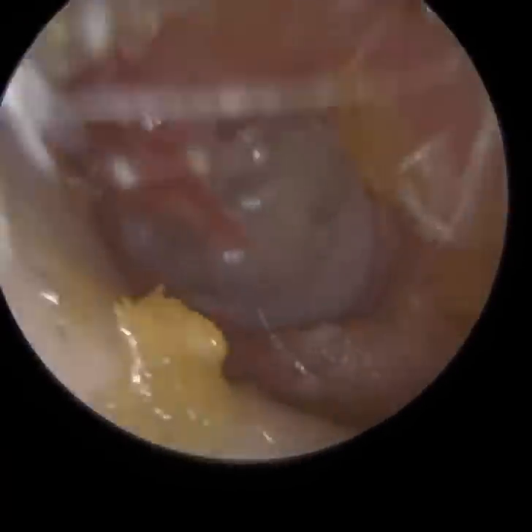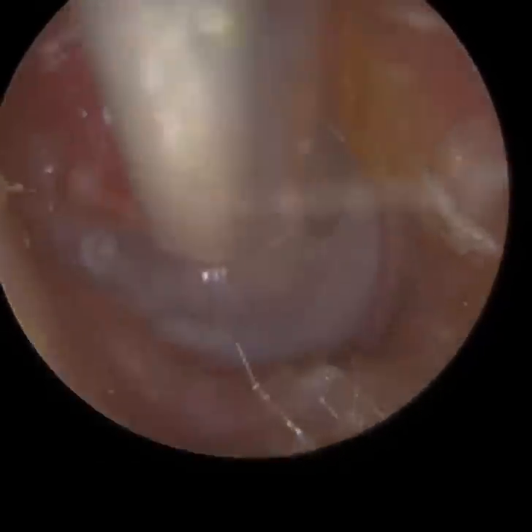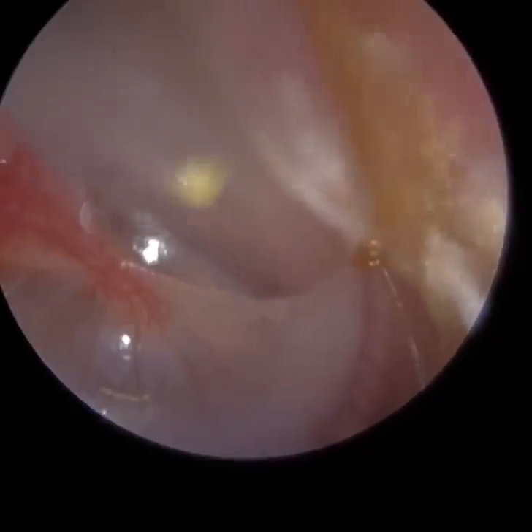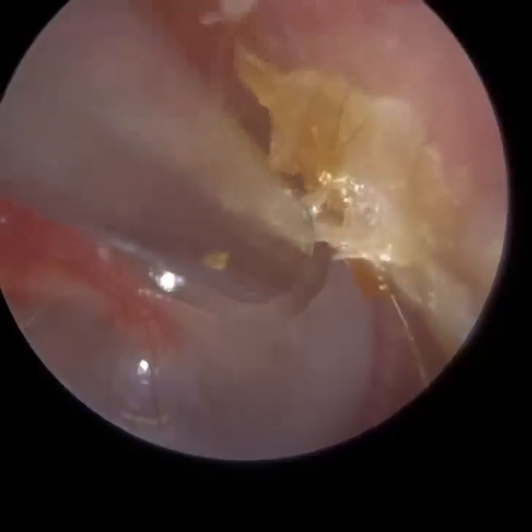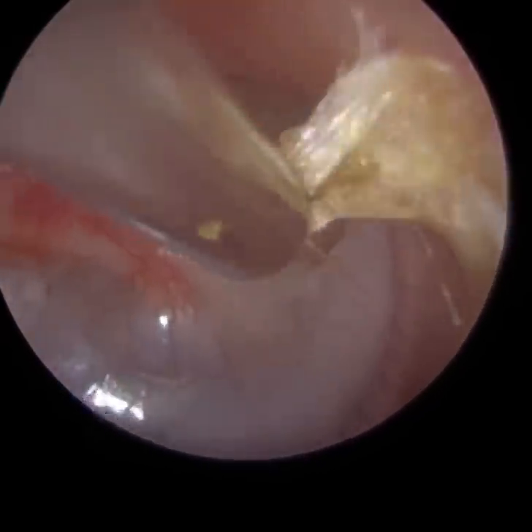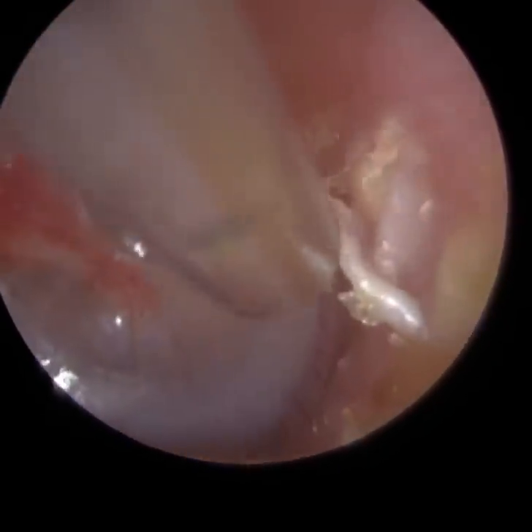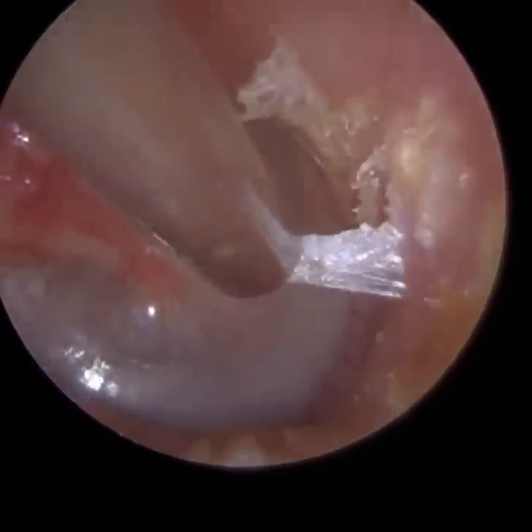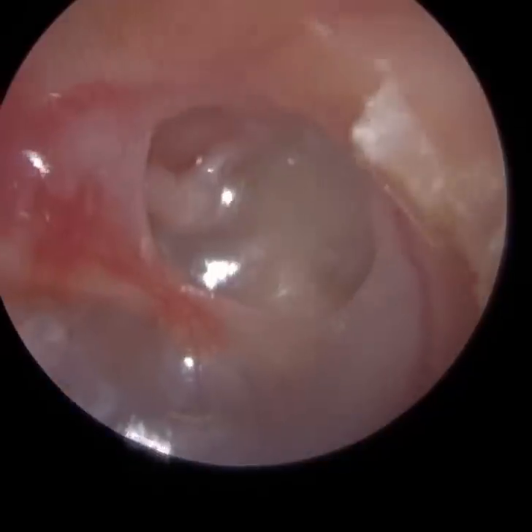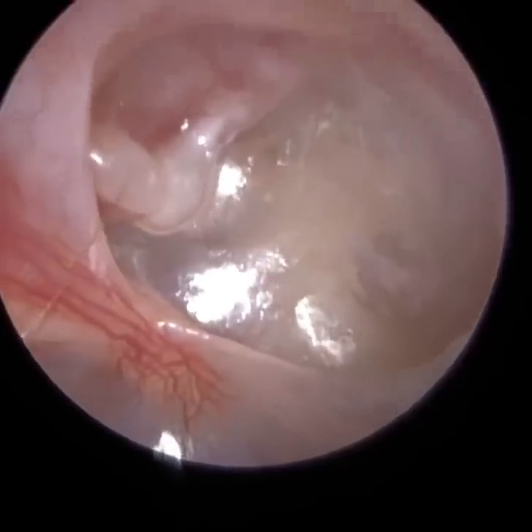That's more for the audiologists who'll understand what the promontory is. We have three bones in the middle ear: the hammer bone, also known as the malleus; the anvil, also known as the incus, which is the second of the three bones; and then the smallest bone in the body, the stapes bone. In this case, we can actually see all three bones. We can see the hammer bone, we can see the incus and its long process, and we can actually see the head of the stapes. So that circle there — that's not a hole. That's a retraction. The eardrum has been sucked into the middle ear.